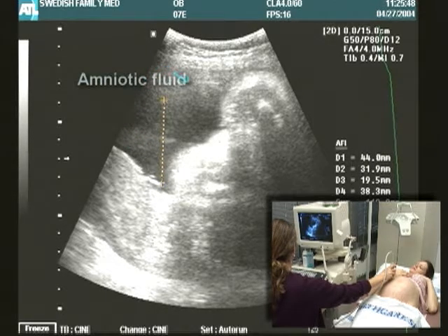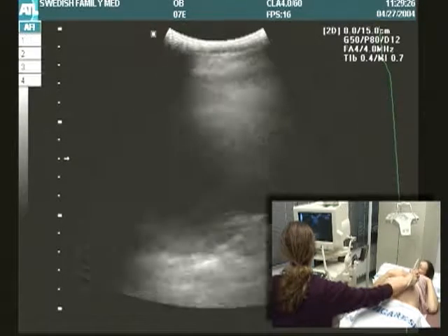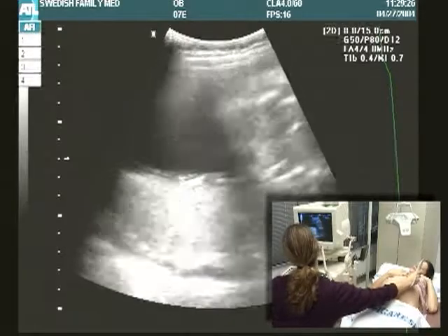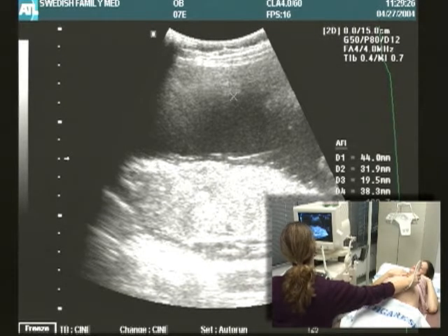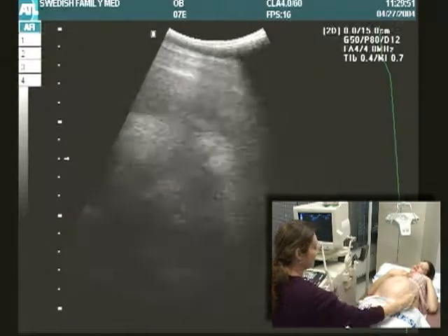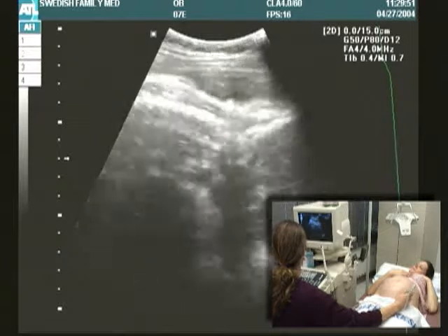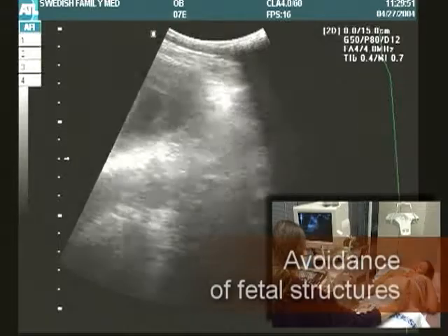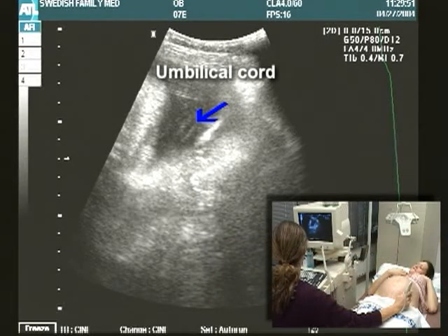The measurement line must be vertical for all measurements. Proceed to the other quadrants. The sum of these four measurements in centimeters is the AFI. When measuring, the line must not cross any fetal part or the umbilical cord.